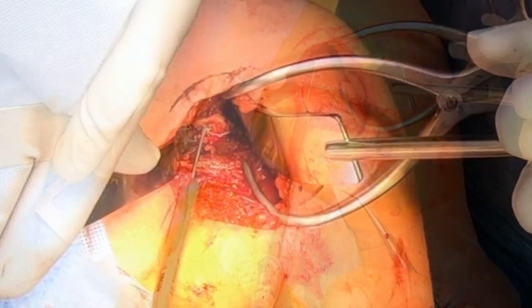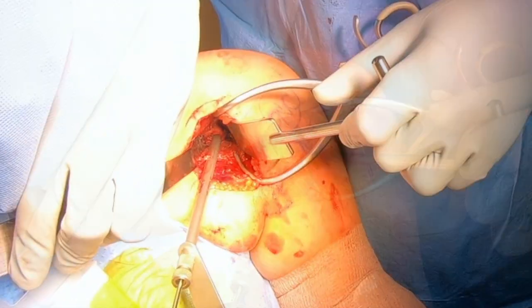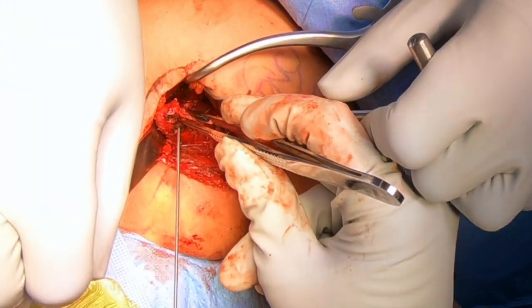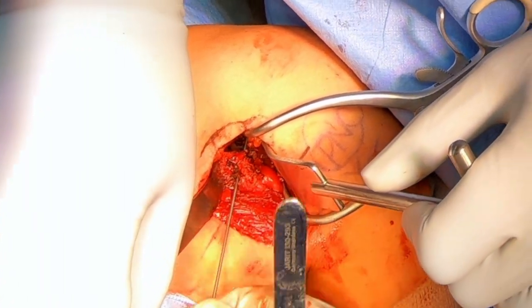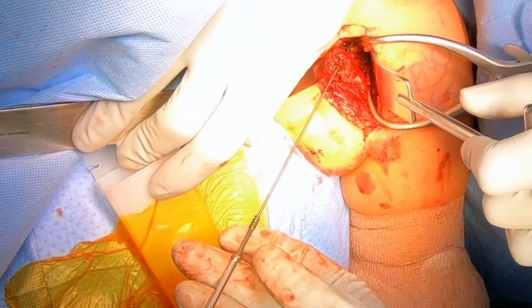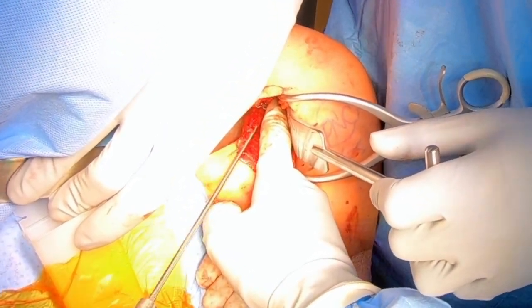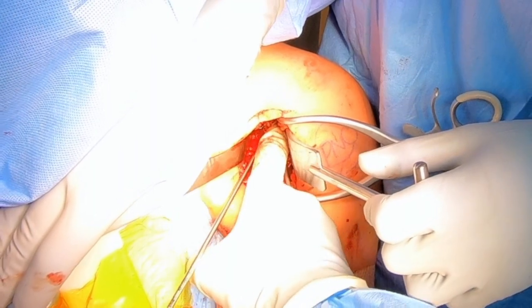Once the wire is placed, we'll double-check one more time — do we like the wire? We'll use the ruler one more time, triple-check, and then drill over the wire. We can then place a wire through our graft and through that hole, which will bring the graft and the front edge of the socket together. Then we can place a screw over the wire to bring those two things together. This technique is very controlled and precise. You'll see me screwing in that screw while making sure the graft is perfectly aligned with my finger as I go.